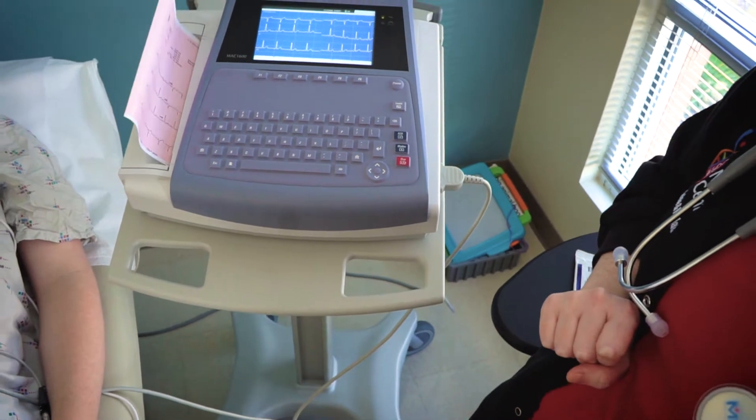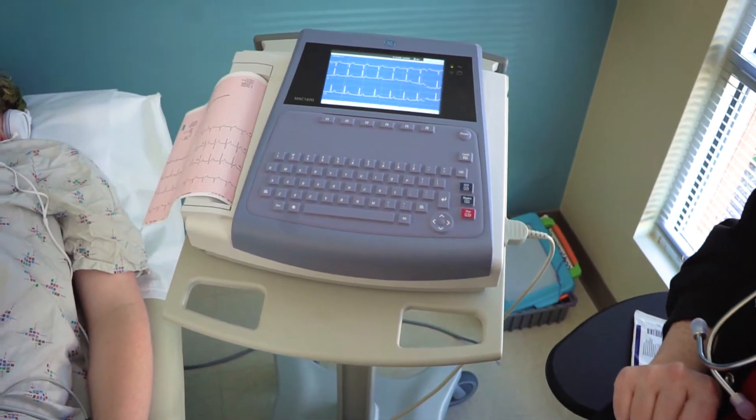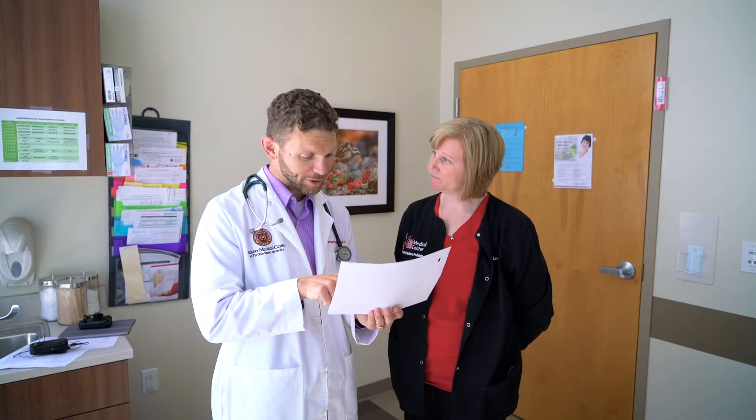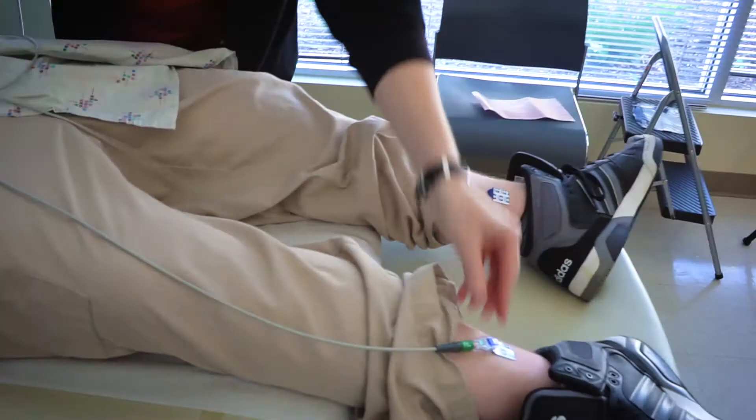Ask the patient to lie still for 30 seconds. Counting or visual timers can help patients achieve this goal. A practice run may also be helpful. It is always best to check with the patient and their support team for best options.